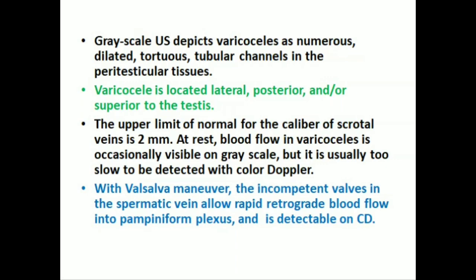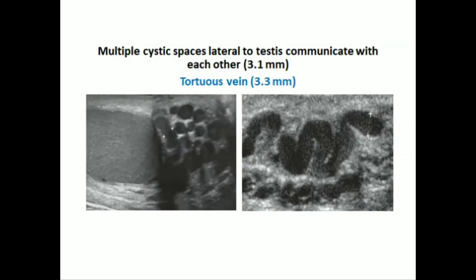Blood flow in varicocele is occasionally visible on grayscale, but it is usually too slow to be detected with color Doppler. With the Valsalva maneuver, the incompetent valves in the spermatic vein allow rapid retrograde blood flow into the pampiniform plexus, which is detectable on color Doppler. These images show multiple cystic spaces lateral to the testis communicating with each other; the diameter is 3.1 and 3.3 millimeters.